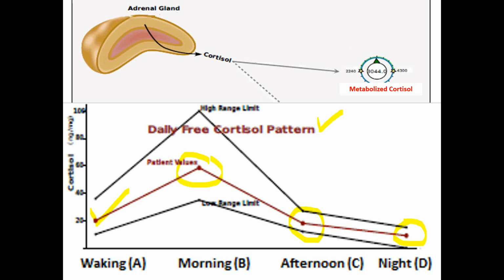So you'll want to look at your patient's results at each of these individual points, looking for dysfunction in that up and down pattern of cortisol. Then we add those 4 up, and for this particular patient, we're on the higher side of normal, yet within the range, for the total of free cortisol. Okay, so that's a picture of your overall circulating free bioavailable cortisol. So again, we're looking for dysfunction in the pattern. We've got the total here. We know it's high normal.